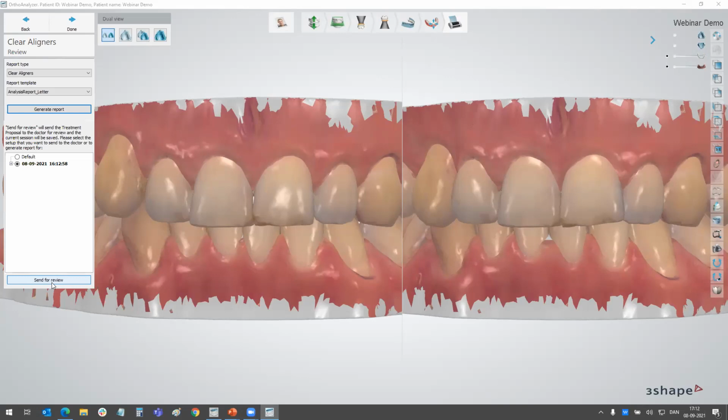So we try to cover the bases here and make sure that you can do it both in the Auto Control Panel and also from within the software. Yeah, and if I can add here, we have training videos available on how to use Treatment Review for both labs and clinics, and also from the clinic standpoint, depending on whether they're a Trios user or if they do not have a Trios, so either another scanner or using conventional impressions.